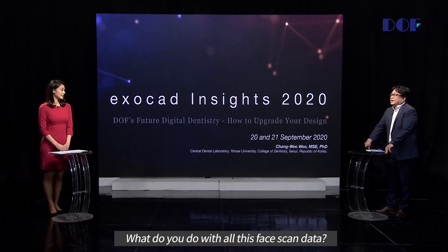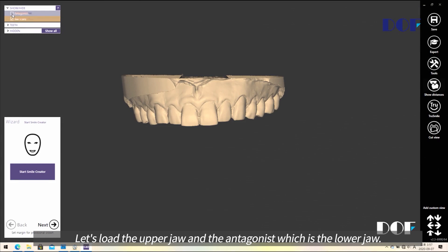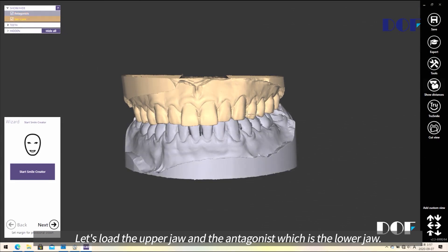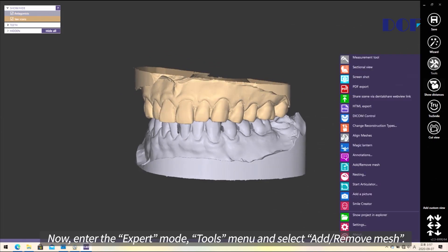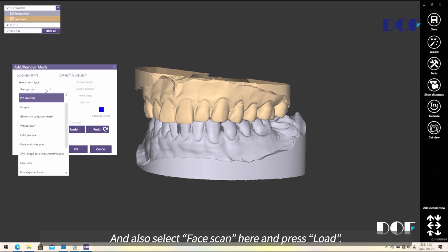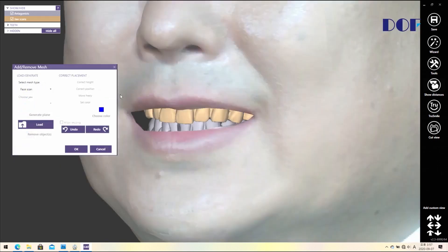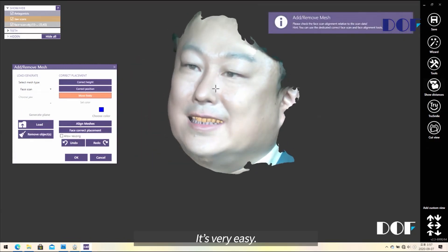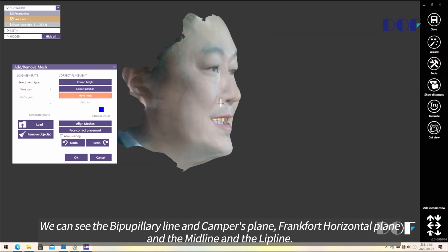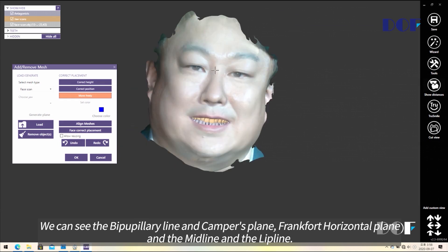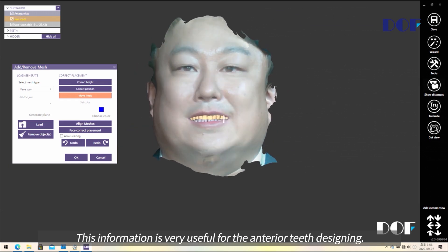Let's load the upper jaw, and the antagonist is the lower jaw. We already have scan data, then we enter the Expert mode and tool menu, and select 'add remove mesh.' We also select face scan here and load. We can see the bipupillary line, Camper plane, front horizontal plane, mid line, and rim line. This information is very useful for anterior teeth designing.